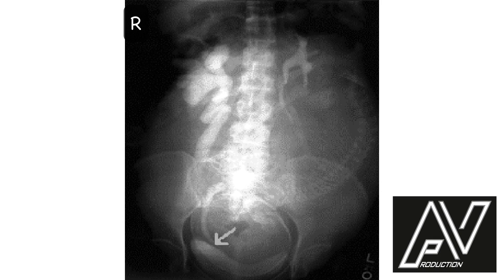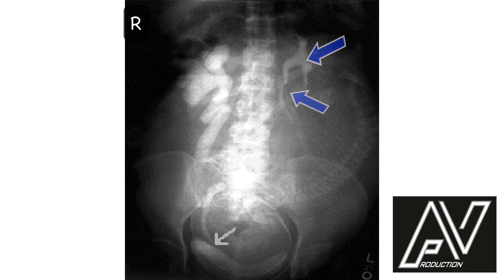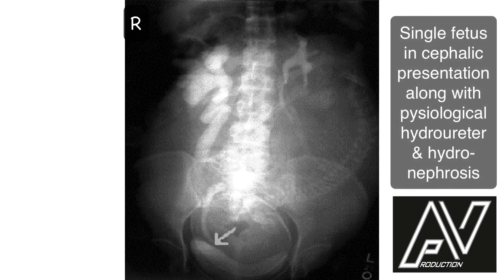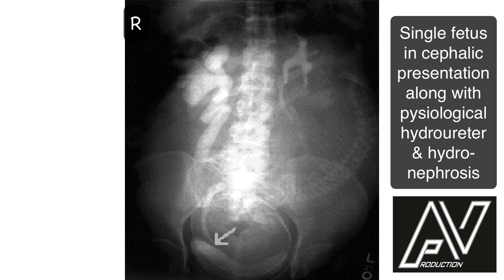This is a special x-ray — intravenous urography — showing AP view of the abdomen and pelvis, well exposed, well centralized. Both the ureters and pelves of the kidneys show dilatation. The right side dilatation is very much more than the left side. Besides this, a single fetus in longitudinal lie, flexed attitude, cephalic presentation is also seen. The white arrow shows compression of the bladder by the fetal head. Therefore, my diagnosis is single fetus in longitudinal lie, cephalic presentation, along with physiological hydroureter and hydronephrosis as a result of pressure.